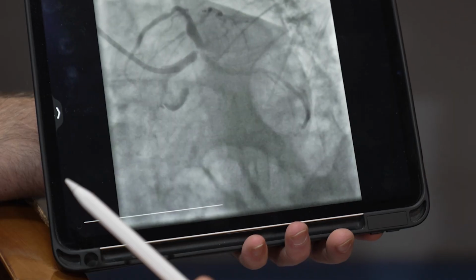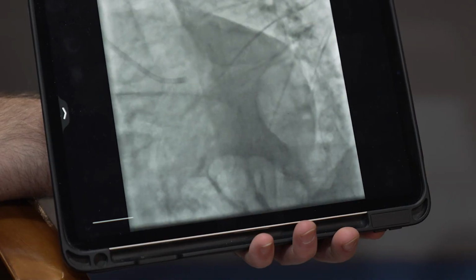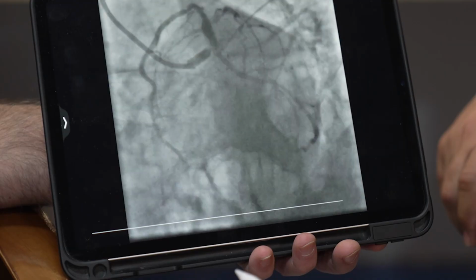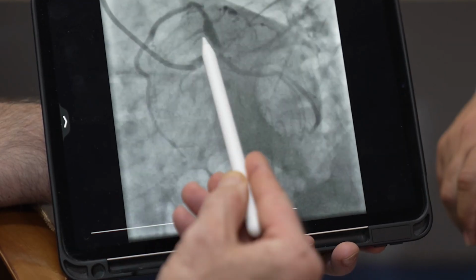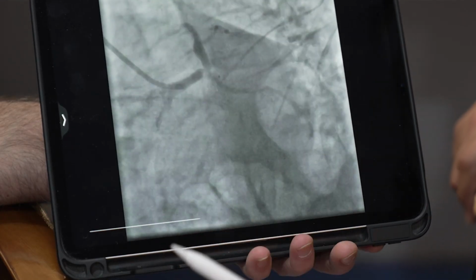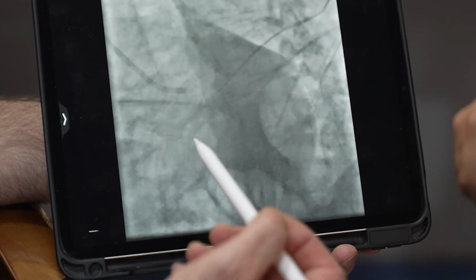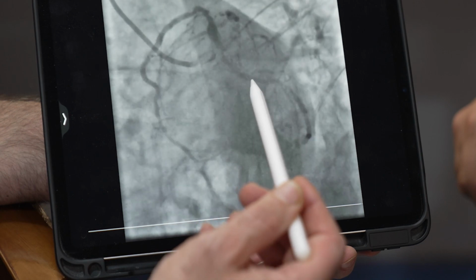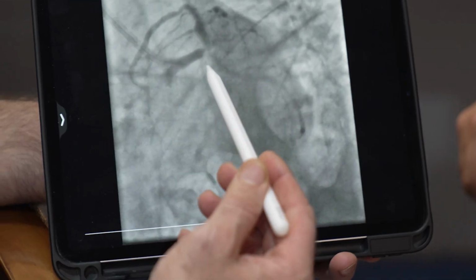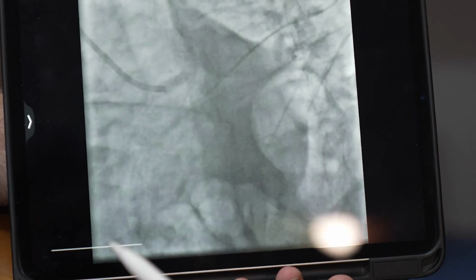What guiding catheter are we going to take? So you prefer to take a good guiding catheter with good support. We may anticipate some difficulty in wiring the LAD and the circ mostly. The problem is with the angulation of the left circumflex. And we have to remember that there is another branch, which is a small ramus here. So the wire may go directly into the ramus. So the first step, we take a good guiding catheter.